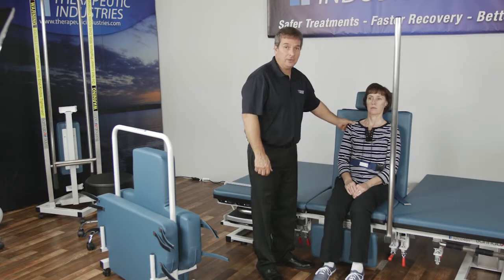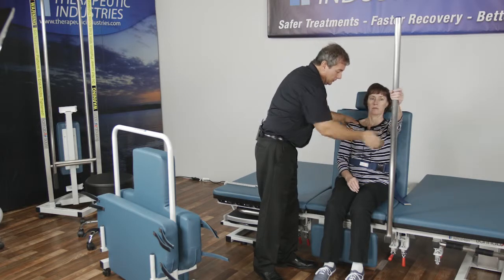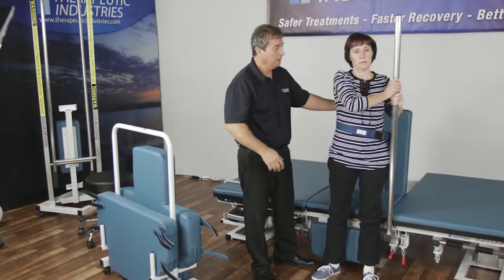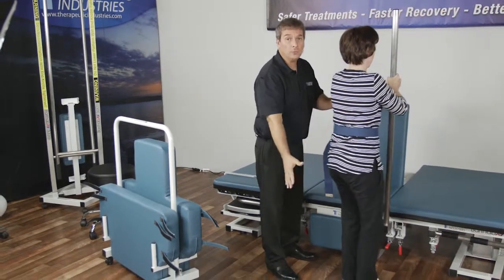Now that we have the patient here we can show them how to reach up to the standing pole, pull themselves up to standing position, and pivot so they can sit on their wheelchair.